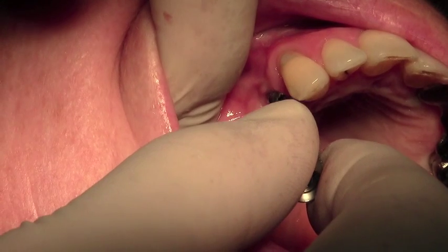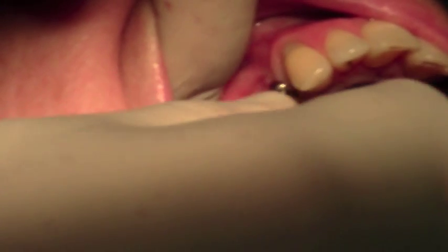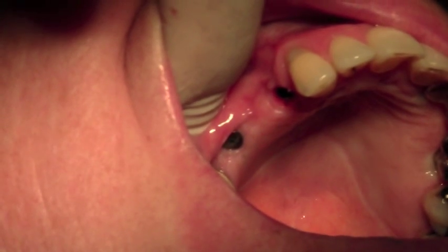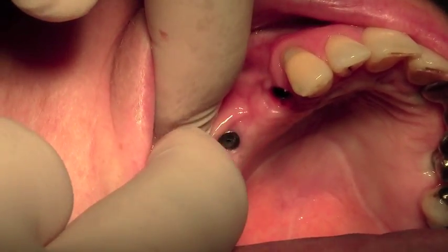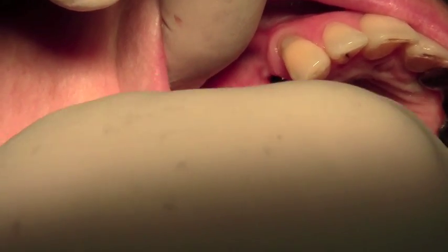I'm just going to take the two healing caps off. We've got the 3.8mm healing cap here — that comes off very nicely. We've got a very nice gum condition indeed around the implant. And then here's the other one in the molar position, and we're just going to unscrew this.